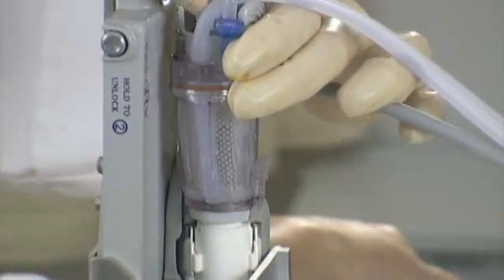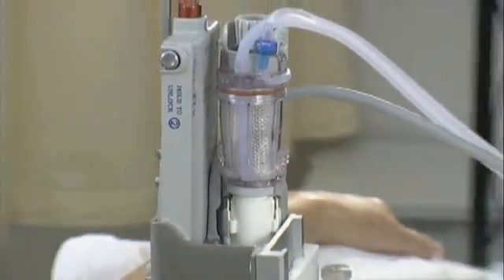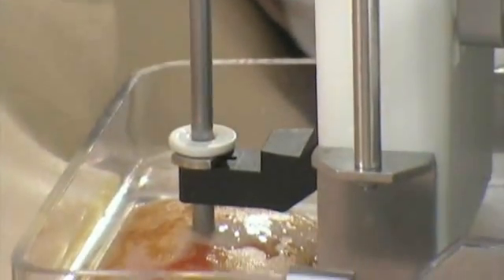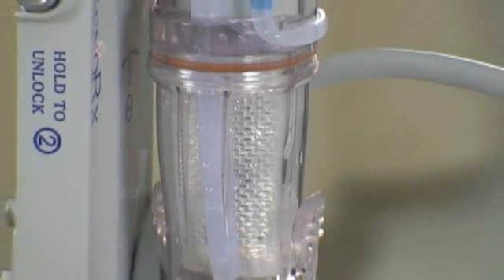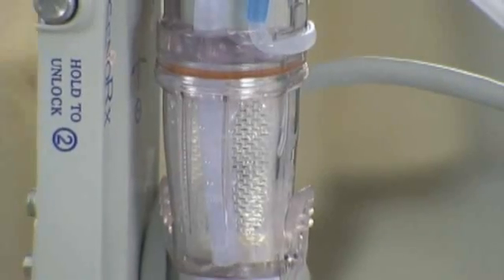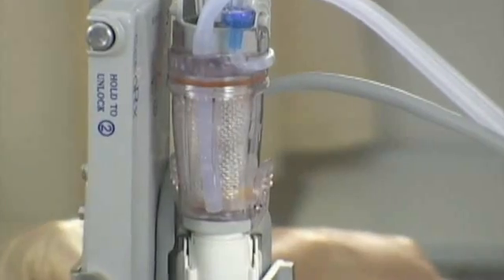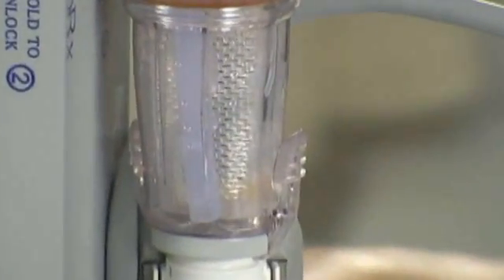I'll close up our system so that we can apply vacuum — we're ready to rock and roll. It's important when you start sampling to look into your chamber to make sure you're actually getting samples shooting back in. I can see some tissue samples coming in now — it's a second check to confirm all systems are go and you have good vacuum. We're getting beautiful samples. We won't know if we have calcifications in any of the samples until we actually x-ray them, which we'll do when we're finished with our sampling regimen.